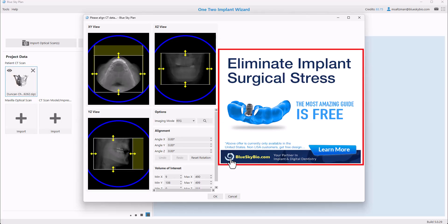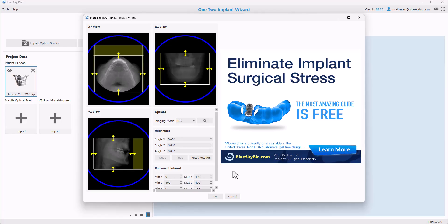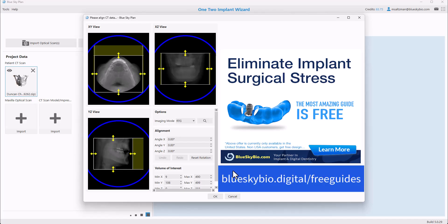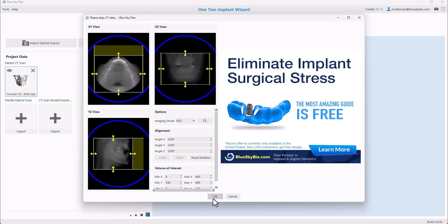We could see on the right side of the screen that we have an ad for free surgical guides. Blue Sky Bio is offering a free surgical guide for your single Blue Sky Bio implant cases, and I'll post the link so you could see more information. After you've identified the relevant field of view, simply click the OK button.